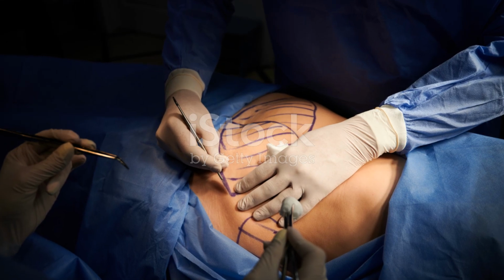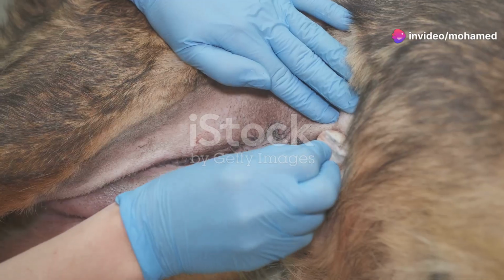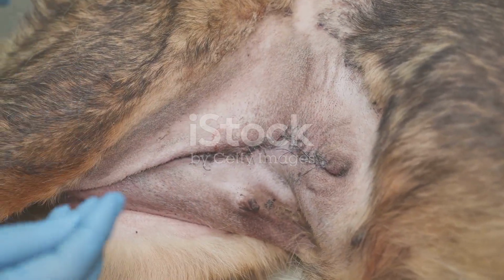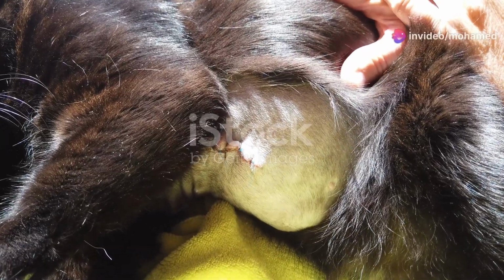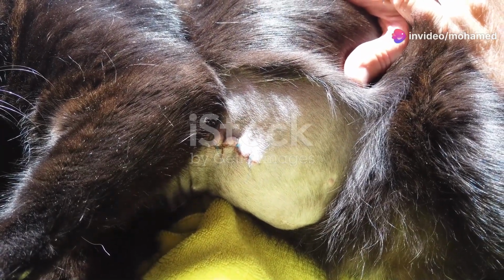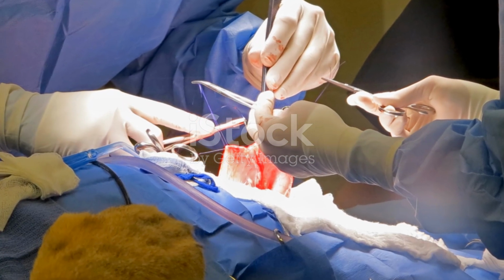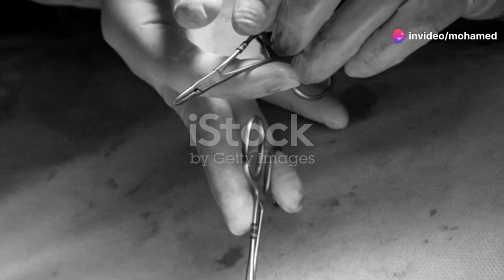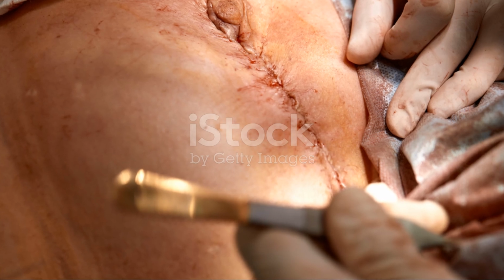Now, there's also a choice between natural and synthetic sutures. Each has its own set of advantages and considerations. Natural sutures, like catgut and silk, are derived from biological materials. They have been used for centuries and are known for their excellent handling properties. They tend to cause more tissue reaction and inflammation. This can be a drawback, especially in patients with sensitivities or in areas where minimal tissue reaction is desired. Synthetic sutures, such as those made from polyglycolic acid or nylon, are designed to minimize tissue reaction and offer more predictable absorption rates. They provide consistent performance and are less likely to cause adverse reactions.